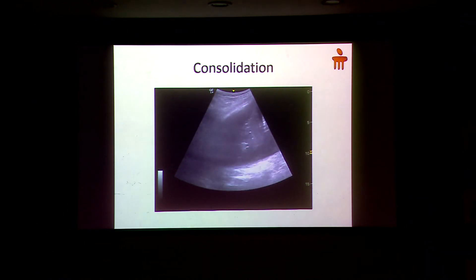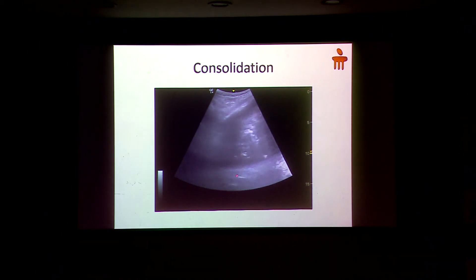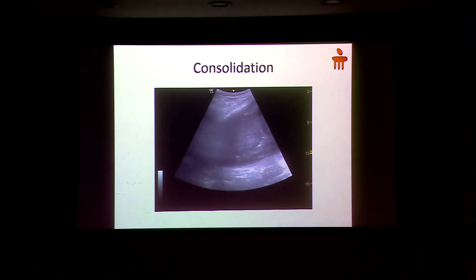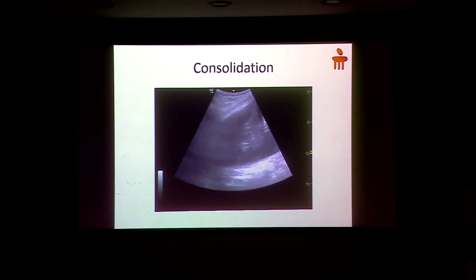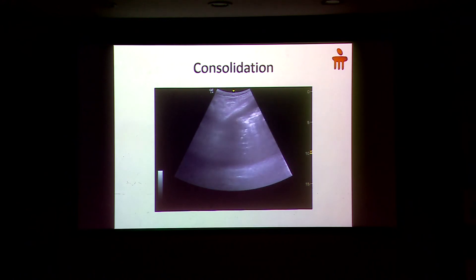They are moving in their shape as well. Another important sign is the dynamic air bronchogram — those white things are becoming brighter and less bright. That is happening because pneumonia consolidation is a pathology which happens in the alveoli; the air bronchi themselves are patent, so air is still going in and coming out. That air movement causes this whiteness to become brighter and less bright. Like the chest X-ray air bronchogram is a hallmark of consolidation, in ultrasound the dynamic air bronchogram confirms that this patient definitely has consolidation, and is useful to differentiate from collapse — in collapse you will not see a dynamic air bronchogram because the whole airway is collapsed and no air is moving.